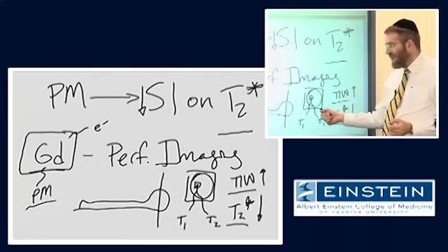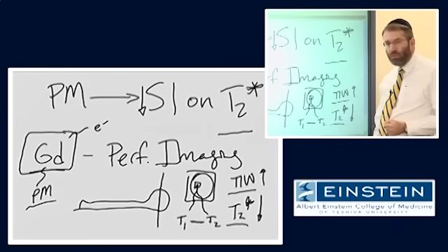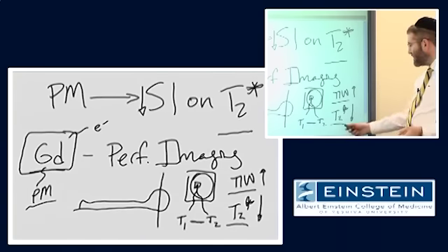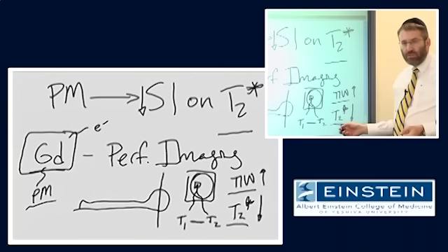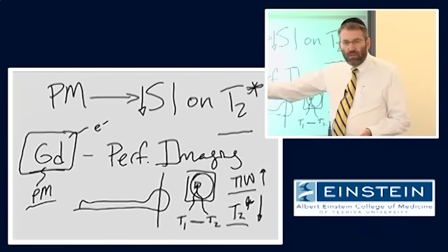If we wanted to maximize our ability to see this difference, what would you do? Well, you'd choose a type of image that was very sensitive to those differences, first of all. Secondly, we would use a lot of this stuff. Right?